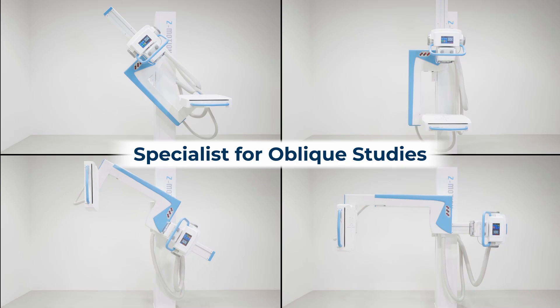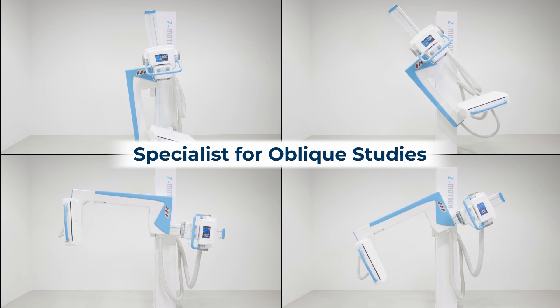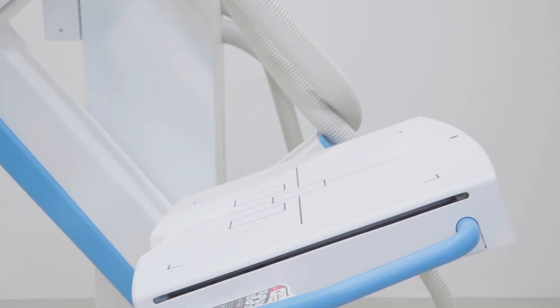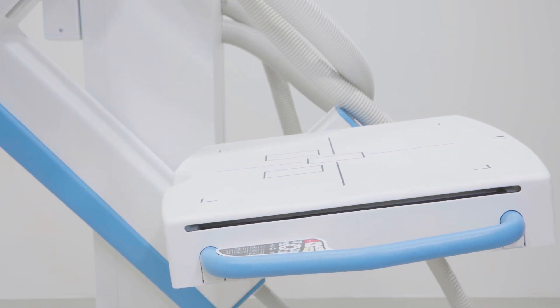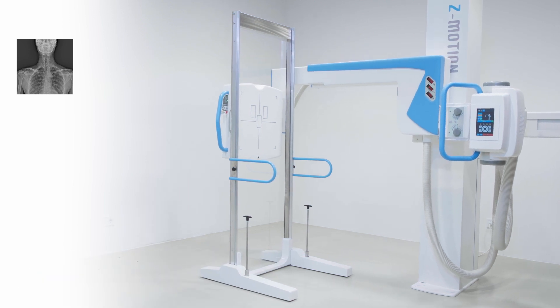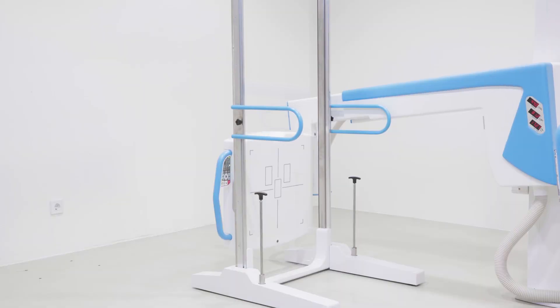The Z-Motion is also a specialist for oblique studies. The arm and the tube assembly move in the full 180 degree range and the detector pivots an additional 90 degrees. The system offers auto-stitching mode for full spine or full leg procedures, capturing two or three frames with a constant focus point.